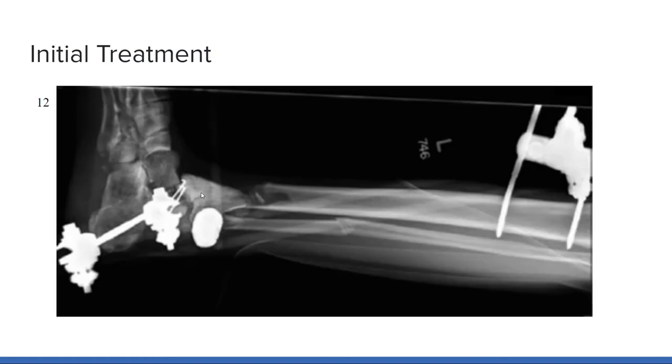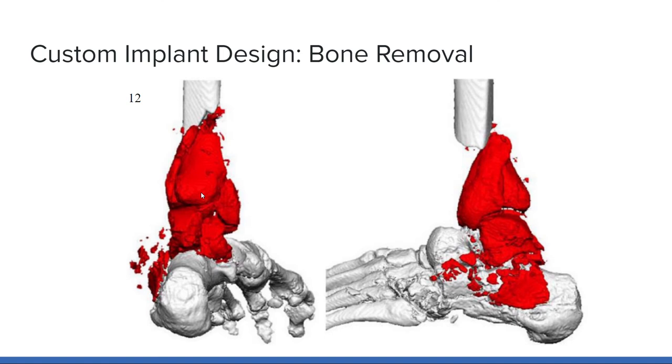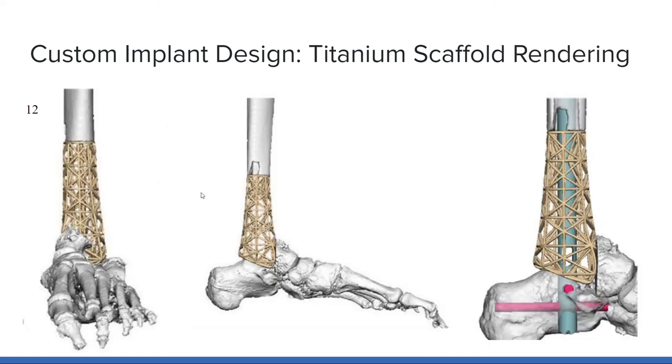After discussions with the patient about treatment options, physicians decided to attempt a novel 3D-printed titanium scaffold design to give her the best chance at regaining normal function. While the 3D-printed design was being developed, the patient was initially treated with a traditional external fixator along with the Masquelet procedure, which uses an antibiotic polymethylmethacrylate spacer to temporarily realign and stabilize the injury. A CT scan was sent to 4Web Medical, an orthopedic implant device company, to design a custom 3D-printed scaffold. Using modeling software, engineers determined which portions of the damaged bone needed to be removed to properly place the new implant, highlighted in red in the 3D rendering of the injury.